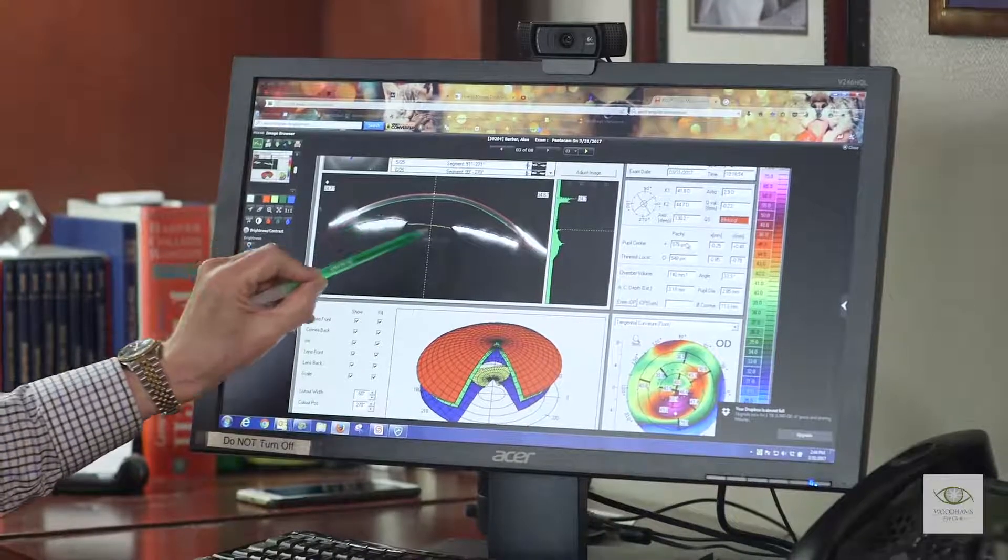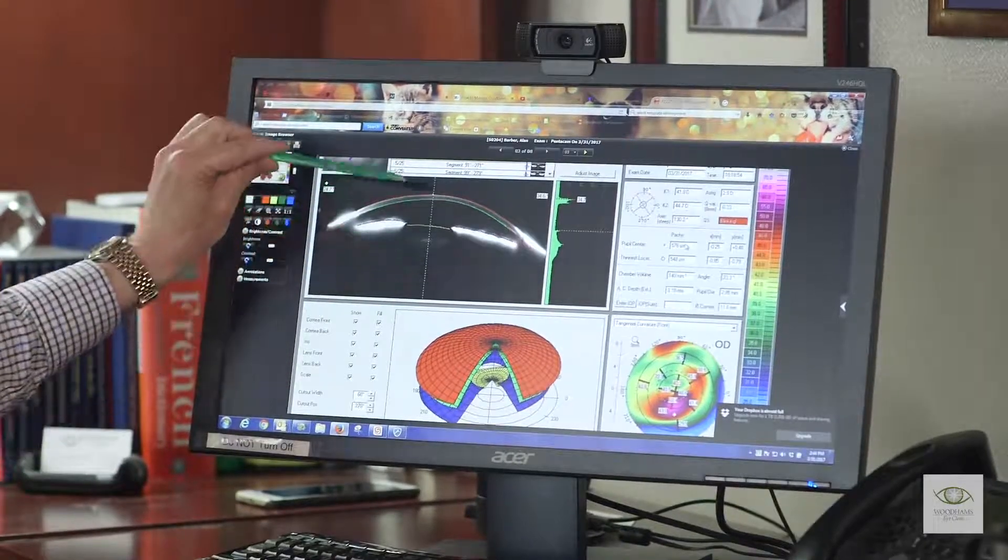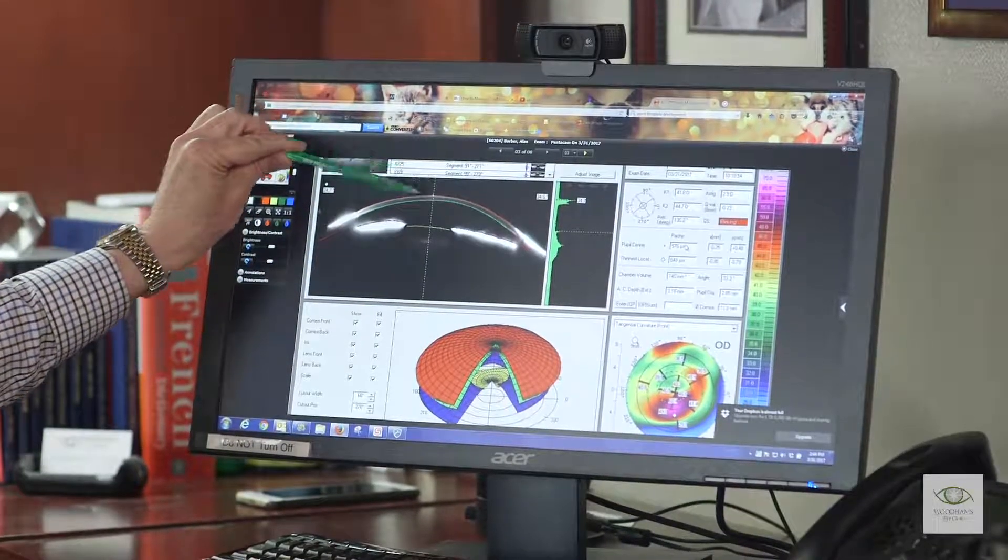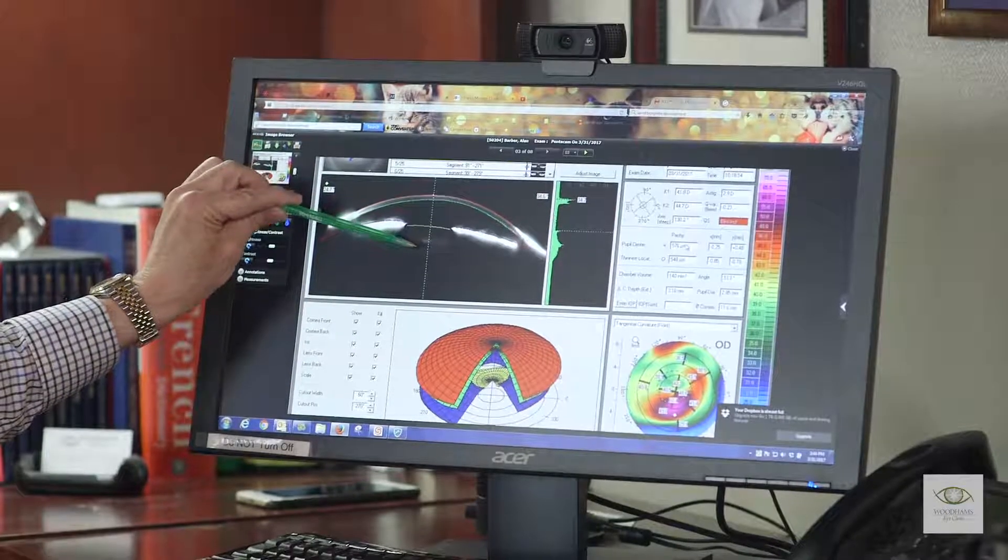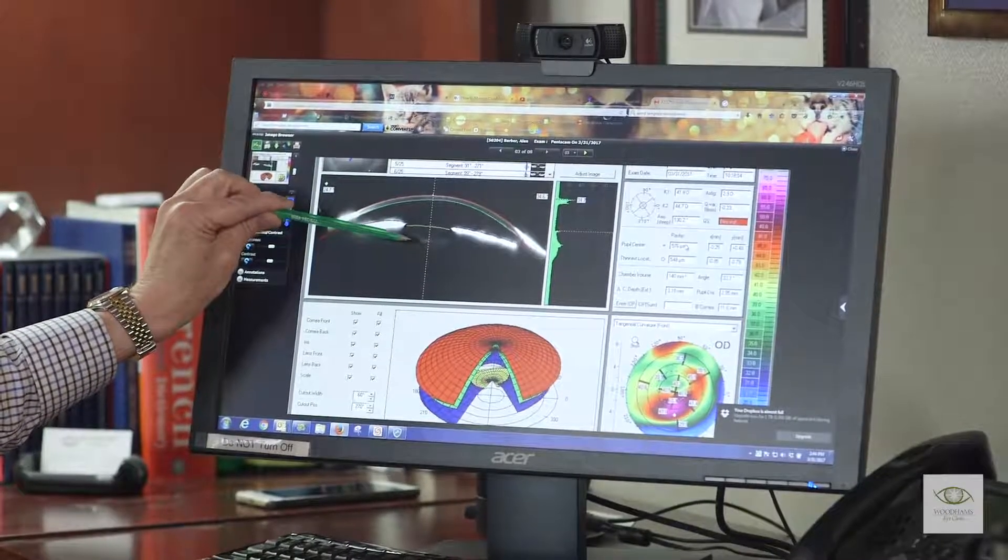The yellow line shows the pupil. This is a flash picture where the light goes through the pupil and hits the lens. If the lens were completely clear, you wouldn't see anything—it would be black.